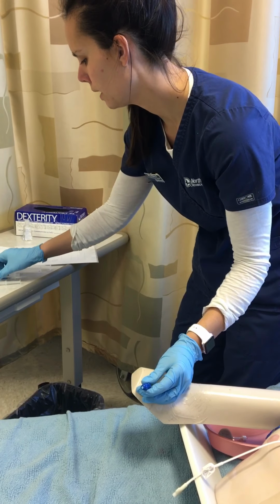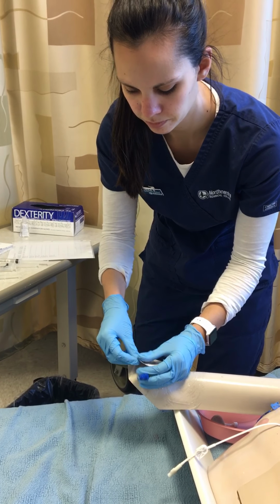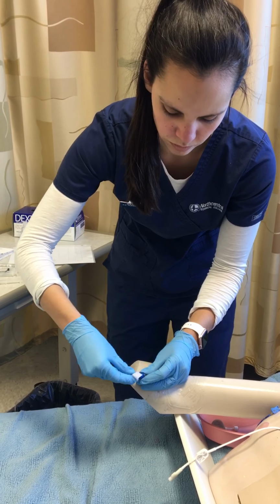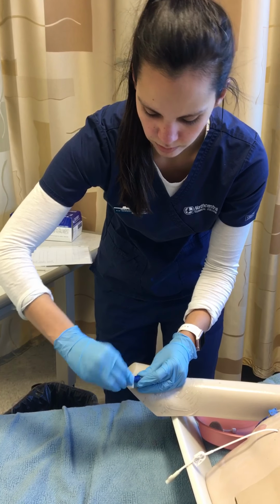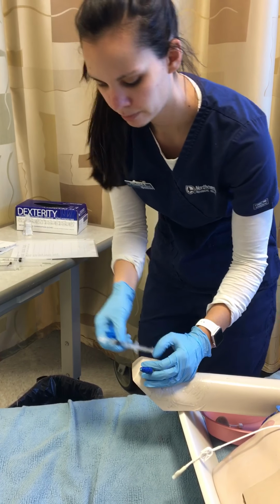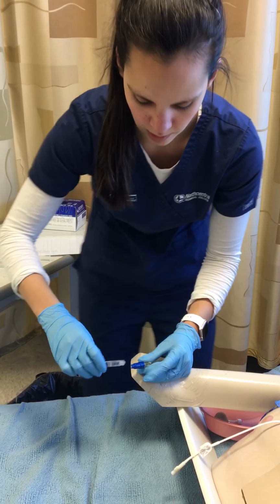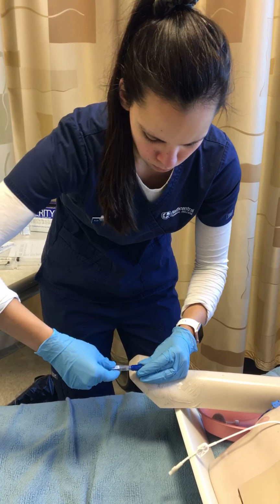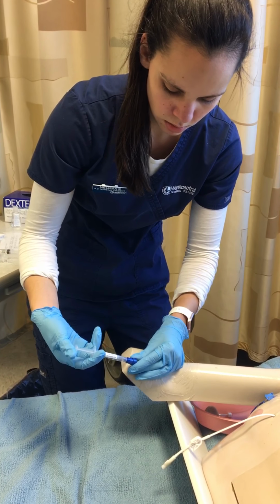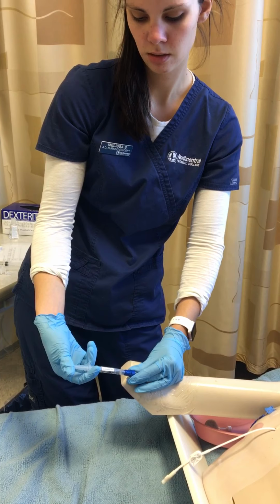Throw that away. And then I would take my med and unclamp it, and I would give my med over 5 minutes.